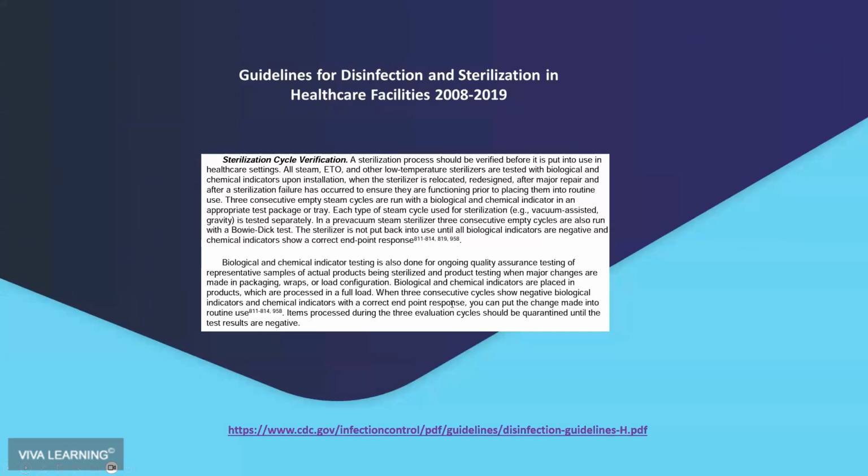This is directly from the guidelines for disinfection and sterilization in healthcare facilities that I just mentioned. And here's more information that talks about not putting a sterilizer back into use until the biological indicators are negative, that it's been tested.